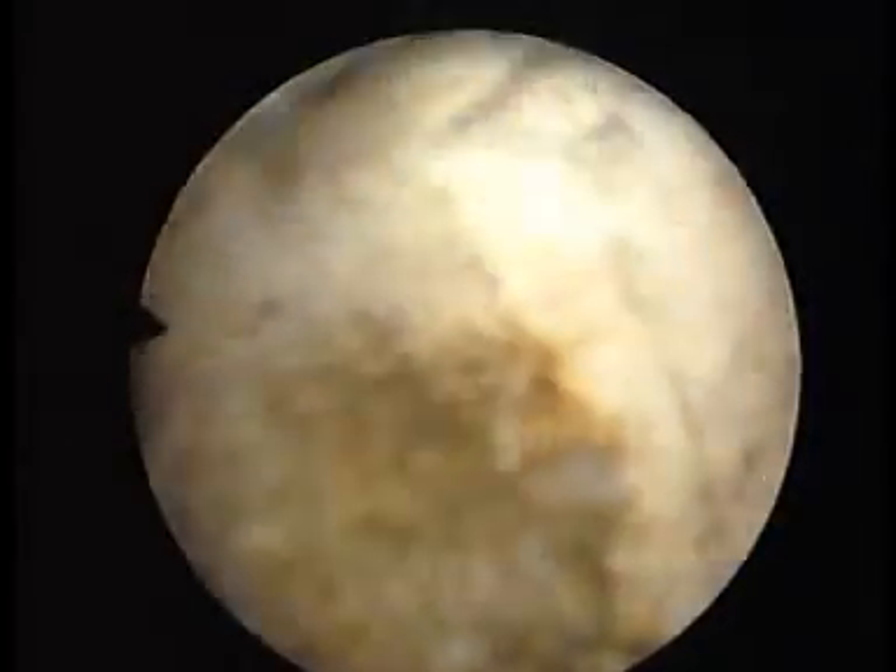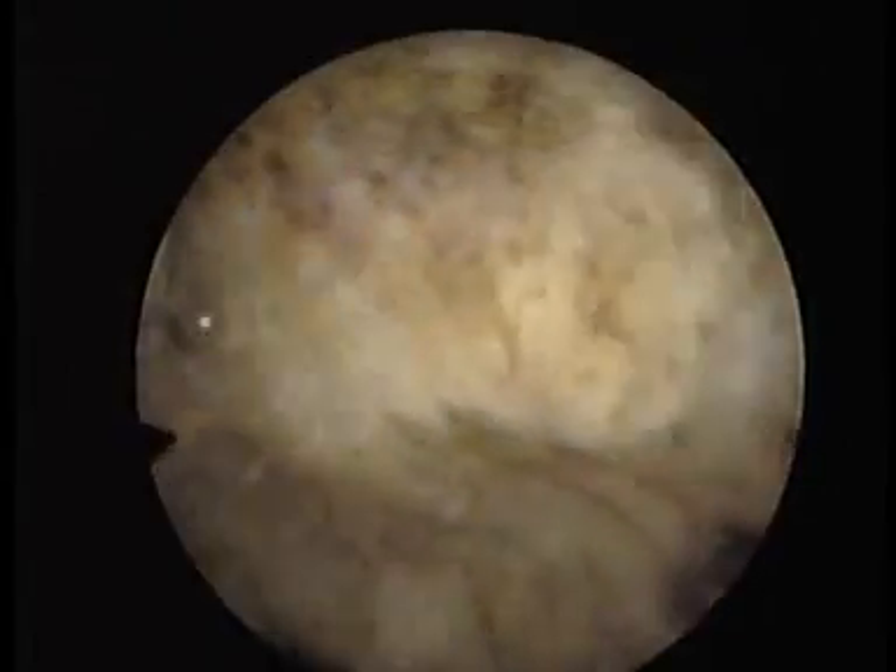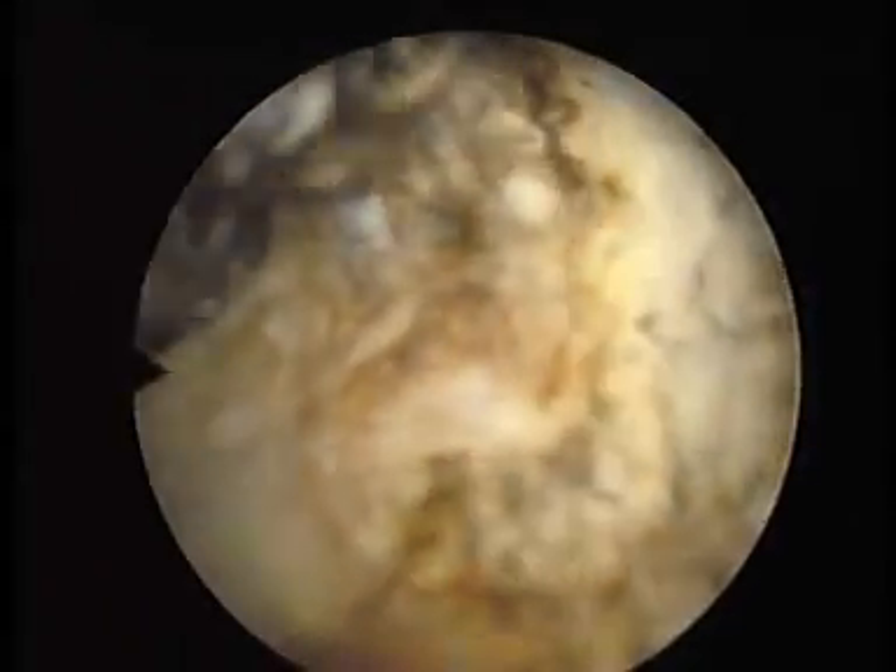Here you can see the loop gently passing around the three o'clock point towards two o'clock now, producing a cavity within the prostate. You can see from time to time small vessels are opened up, and these are usually cauterized using a different setting.